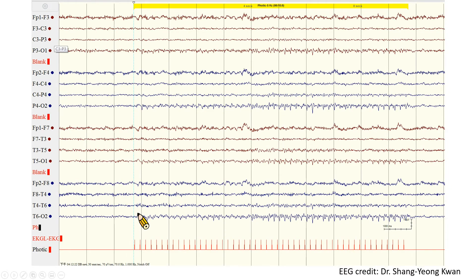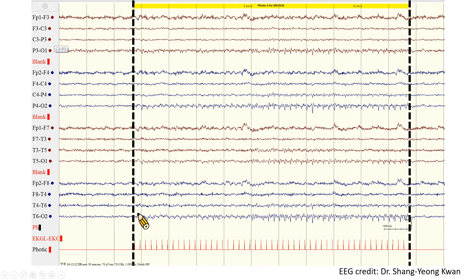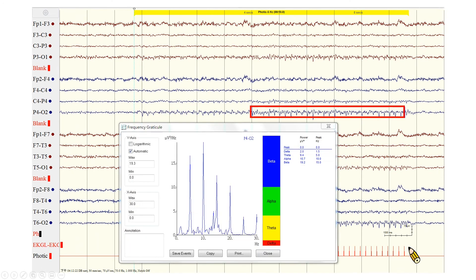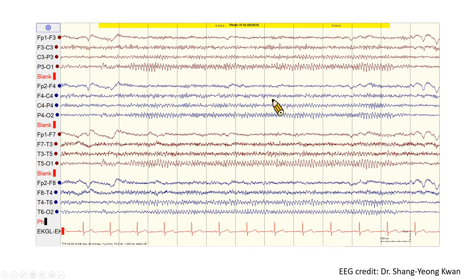Here is another example. Under IPS with 5 Hz, we can see photic driving response over occipital regions, time-lagged to the photic stimulation period. By using spectral analysis, we can easily identify the beautiful harmonic driving response, which shows integral multiples of 5 Hz. Another example of harmonic driving while under IPS of 11 Hz — spectral analysis confirms the presence of harmonic driving response with 11 and 22 Hz.